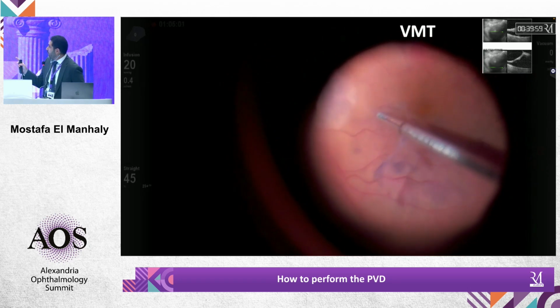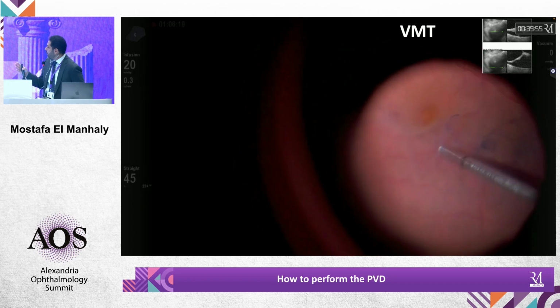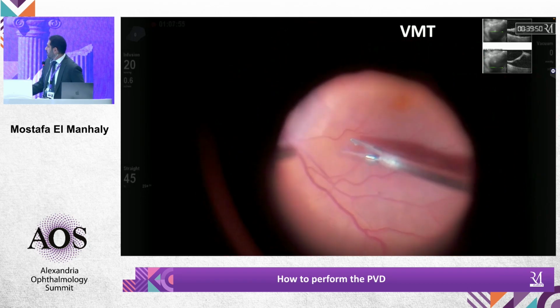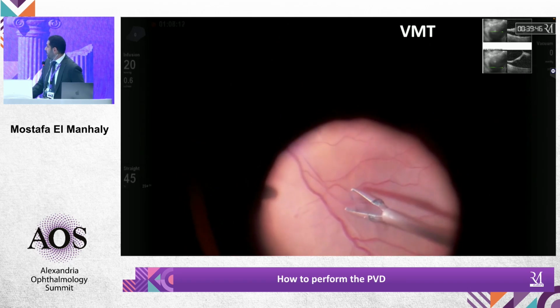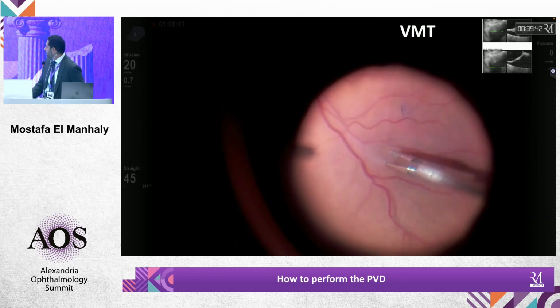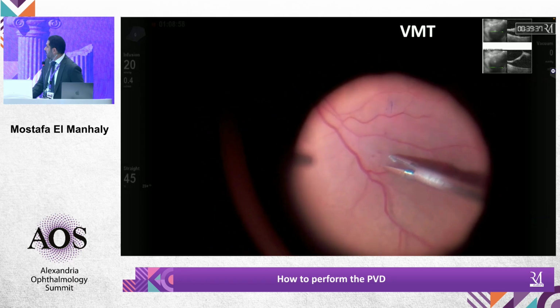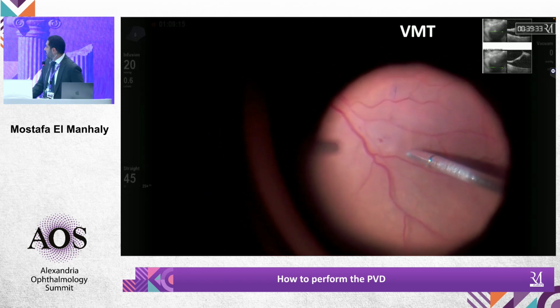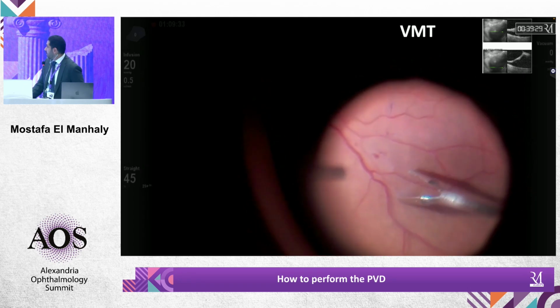Okay, so after we remove this part, under this layer we will have another unstainable layer that is shredding. You can have several layers of an epimacular membrane, by the way. So it's this layer, an epiretinal membrane, that is being removed now. Is it a membrane or remnants of the cortical vitreous? Could be a membrane mixed with some of the cortical vitreous, but it's really hard to judge from the video. But I think the consistency of the posterior hyaloid is different from the consistency of an epimacular membrane. Sure, they behave differently under the forceps.